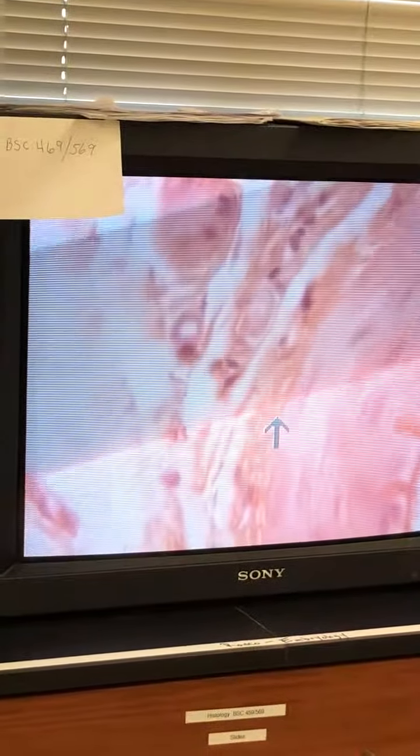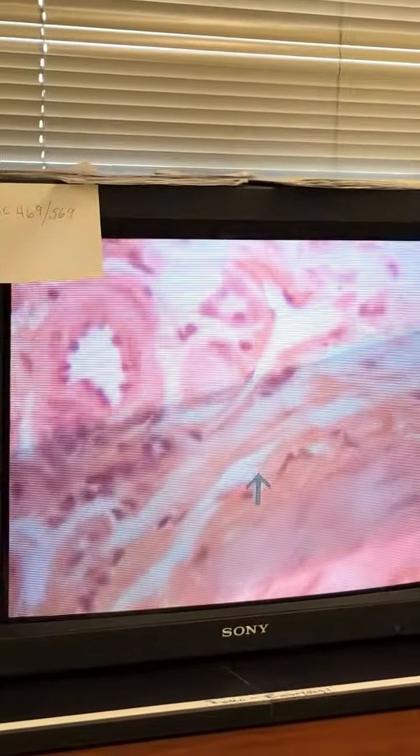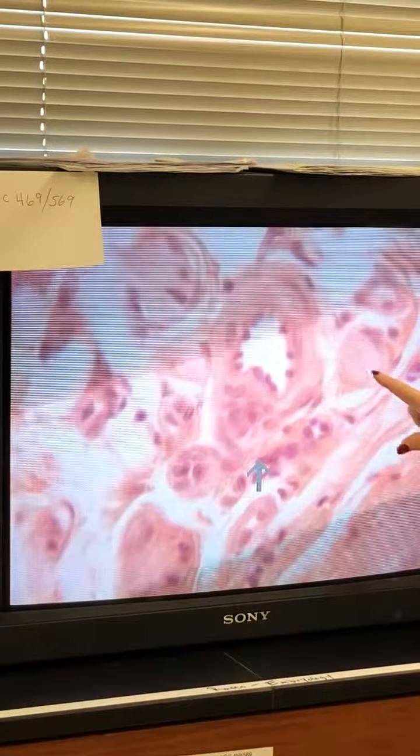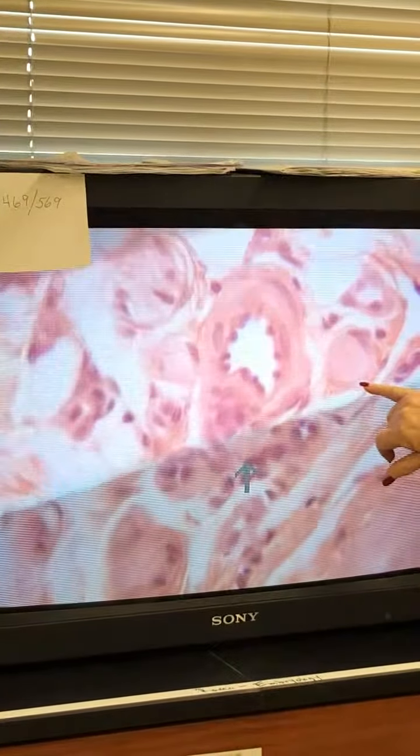Let's see, this is having a plethora of good stuff here. The only thing is that I wouldn't use this slide, but if we could pretend that this is in the adventitia, which it's not, name this structure. The nervi, whatever that thing is.